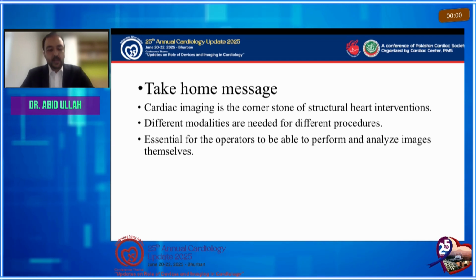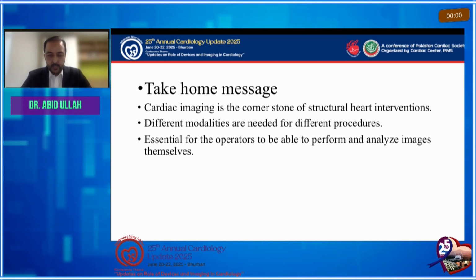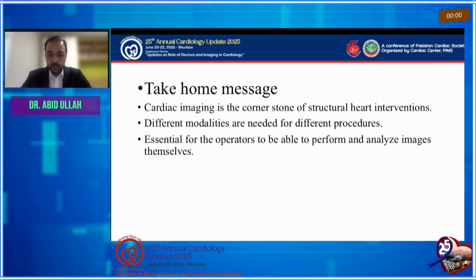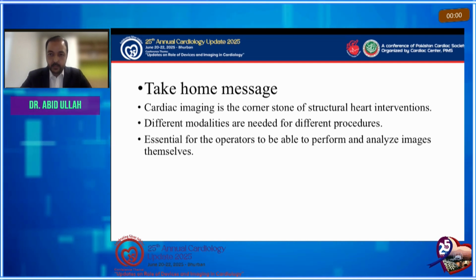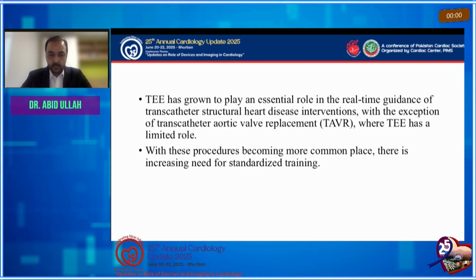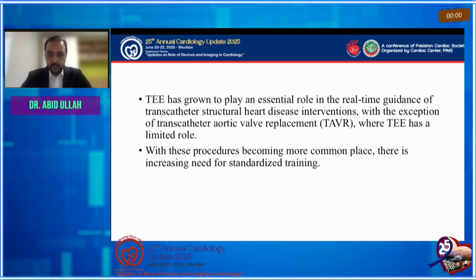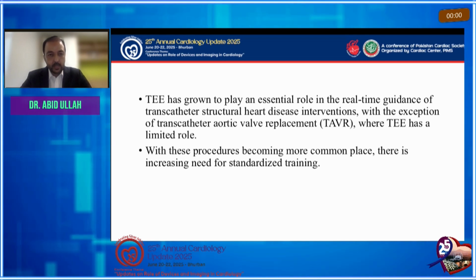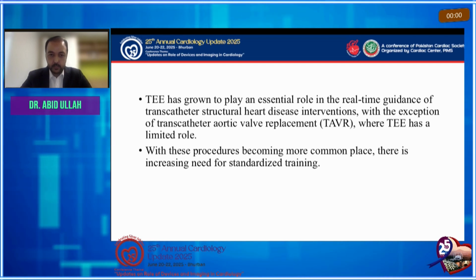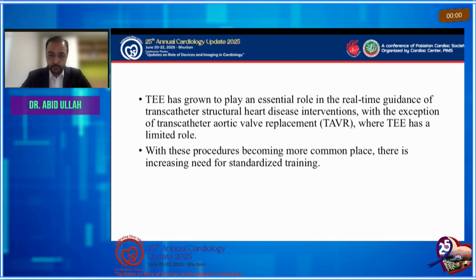I think that cardiac imaging is a cornerstone of the structural heart interventions. There are different modalities, and it's essential for the operators to be able to perform and analyze the images themselves. Apart from the CT, which is essential for the TAVI, the transesophageal echocardiography plays a central role in each and every one of these procedures. And I think with these procedures becoming more commonplace, there's a need for standardized training. Thank you very much.